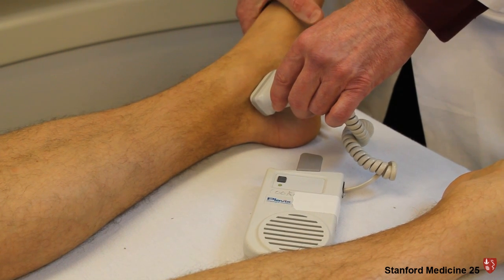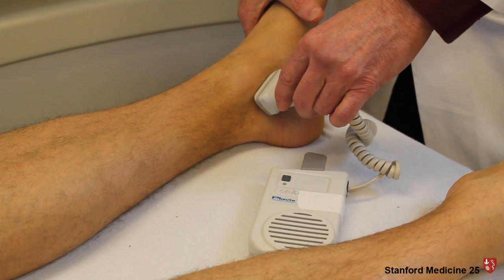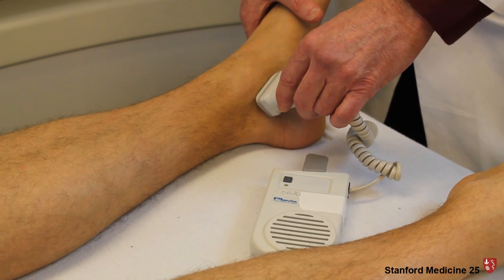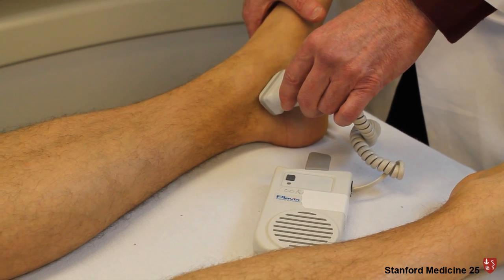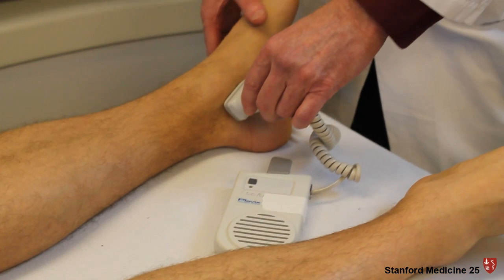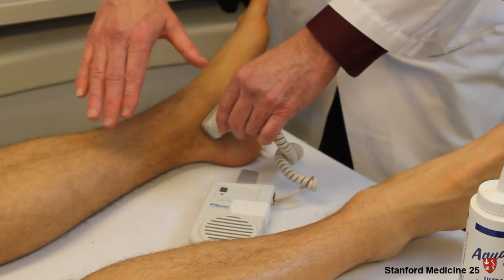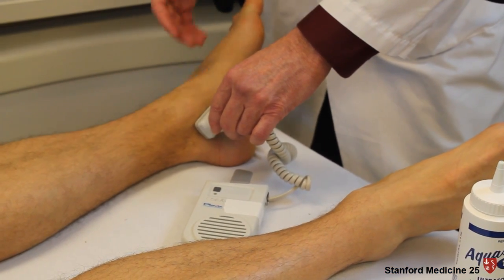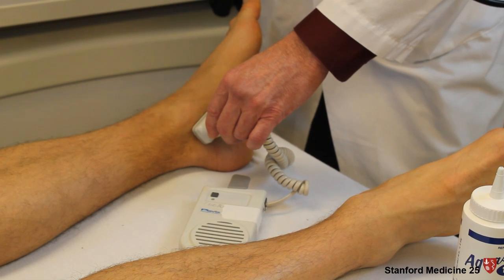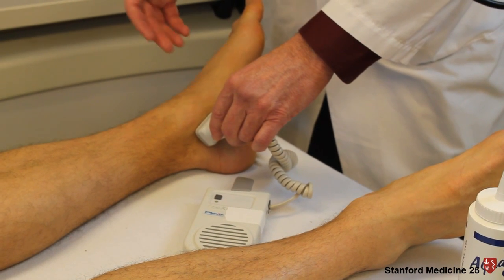What you just heard was venous return being augmented by compression of the foot. And that tells you that at least in this immediate vicinity, the venous return is normal. There's no obstruction.